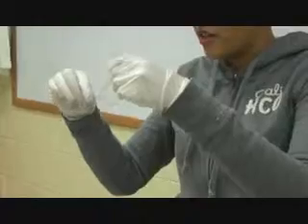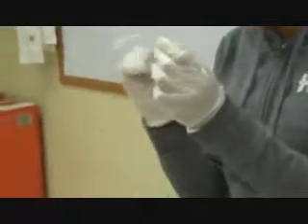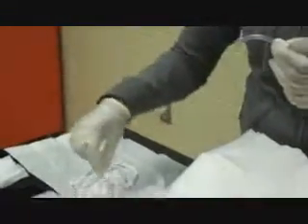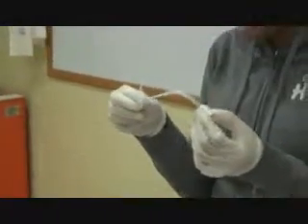the sterile end. And then you will clean the inner cannula with the brush and get it really clean, rub it up. And you clean the inside of the inner cannula with the pipe cleaners. Rub it, making sure not to let your gloves touch it.